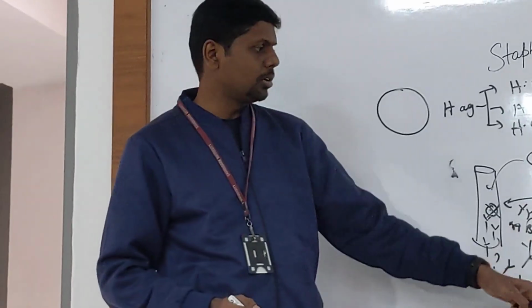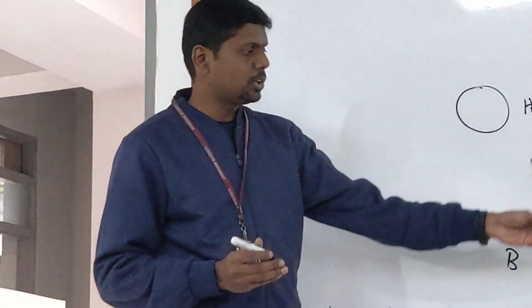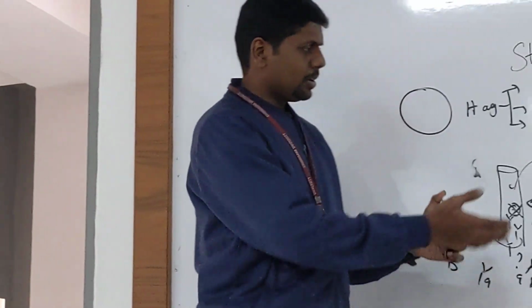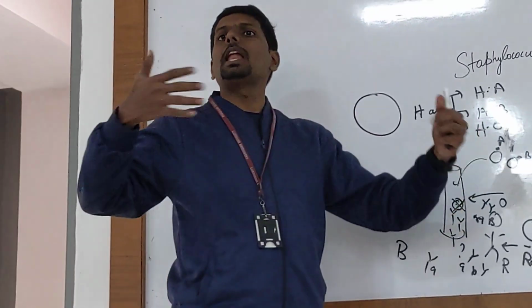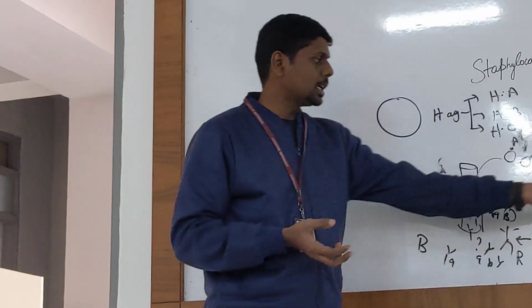Yes, sir. This is a very good reaction. Good blood transfusion. Universal donor only. And what is the meaning of universal donor? All groups will accept their blood. Yes, sir. All groups will accept because they are O group.